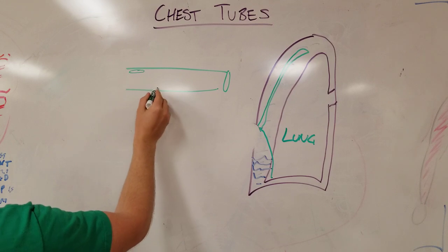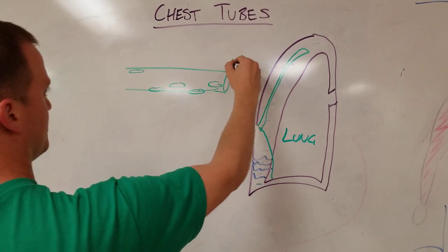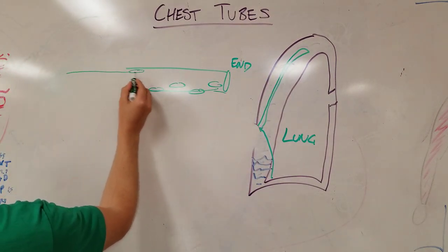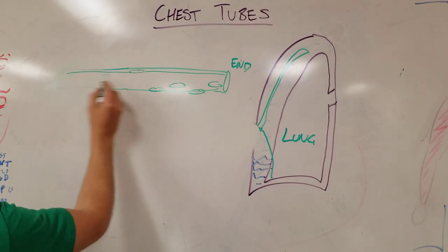It can be more, it can be less. And you have other holes at other orientations along the end of the tube. So this would be the far end, the distal end. This sentinel hole is important because it has a radiopaque line going on the chest tube for its entire duration, except for that sentinel hole.